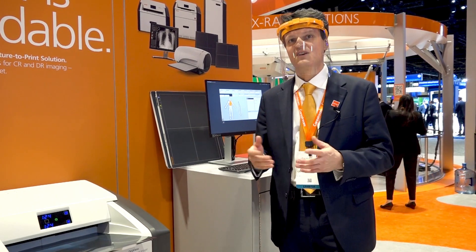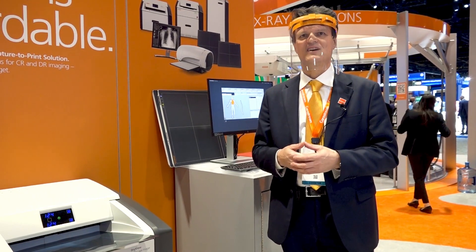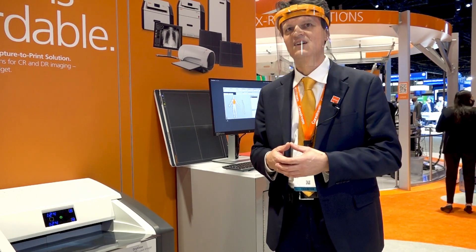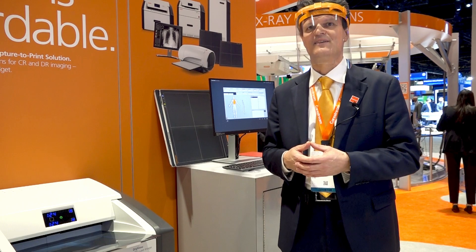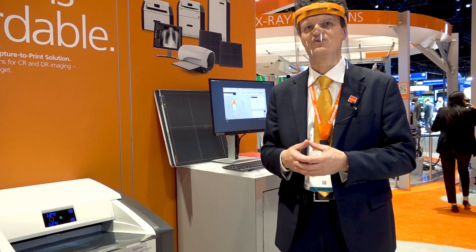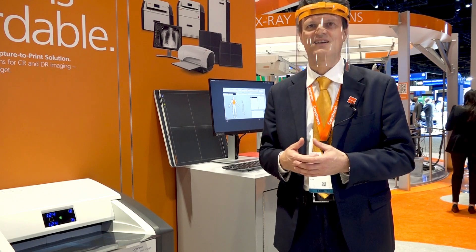If so, it might be the right time to go digital. The CareStream focus detectors with the powerful ImageSuite software give you an easy and affordable way to achieve your goal with no expenditure to replace your existing X-ray room.